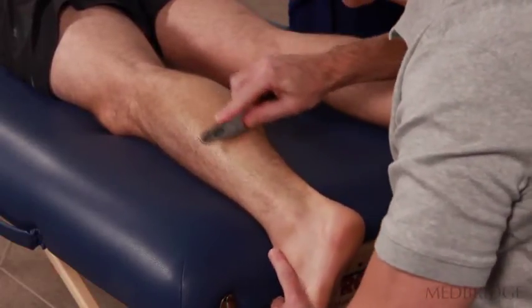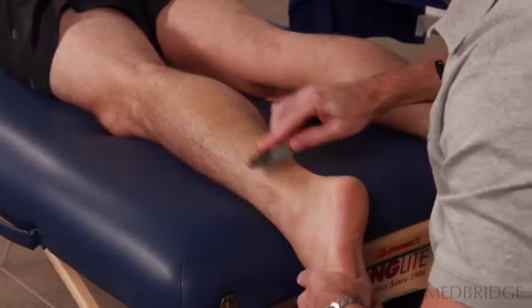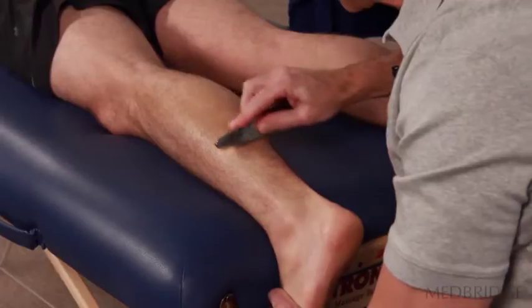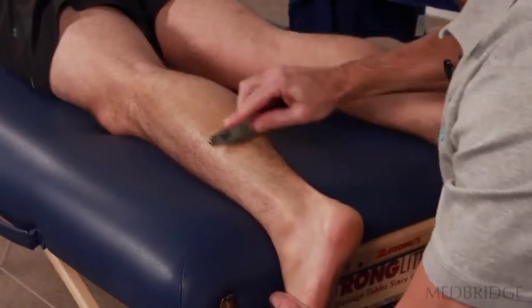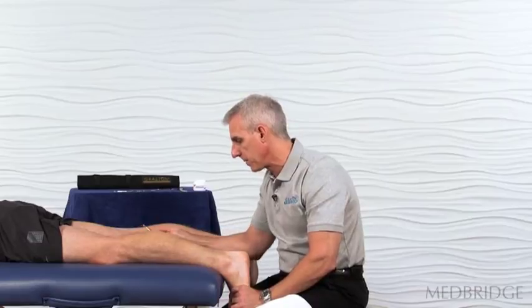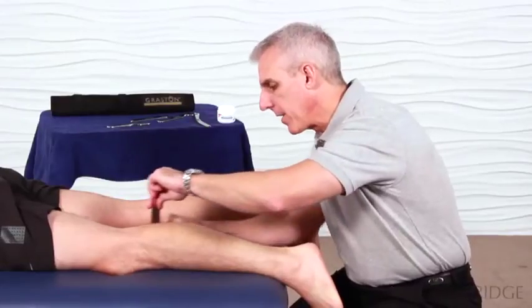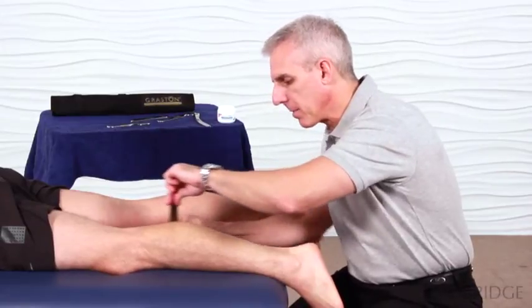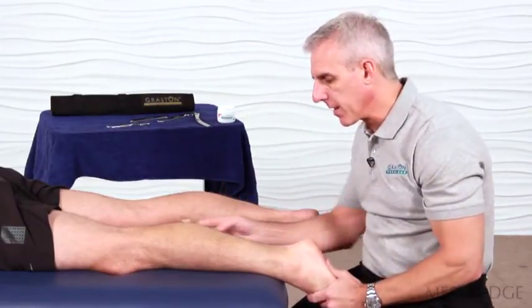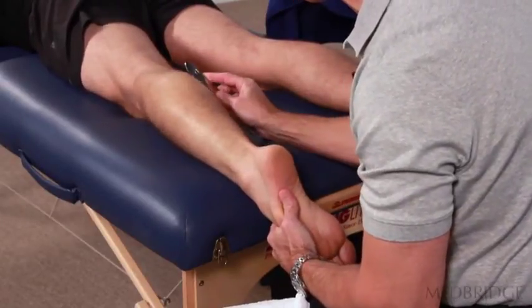I can change tissue tension by either dorsiflexing or plantar flexing the ankle. If I put the ankle in dorsiflexion, the superficial tissue would be on stretch and it will be a more aggressive intervention. On the other hand, if I wanted to get a little deeper, I could keep the ankle plantar flexed — this would allow me to work through the superficial tissue to get to deeper structures.